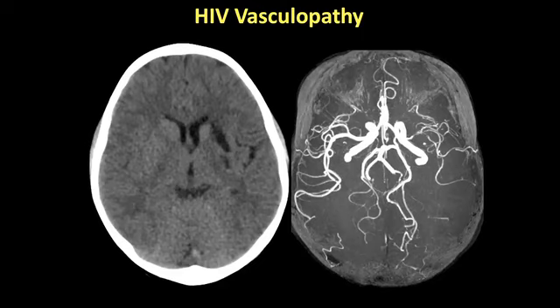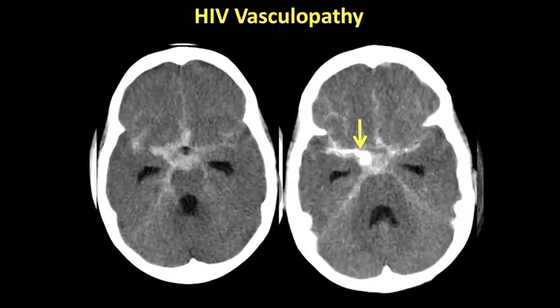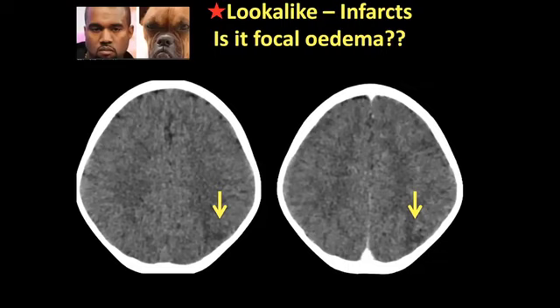If we have excluded varicella, mycoplasma, or TBM as the cause of it, and we're not 100% sure what causes it, we think it is immune dysregulation causing endothelial dysfunction, and we can have stenosis, as in this case, we can have aneurysms, as in this case, or the patient can even present with a moya-moya type picture. So it's one of the important negatives to consider in a patient who's presenting with an acute stroke, particularly in the setting of infection.